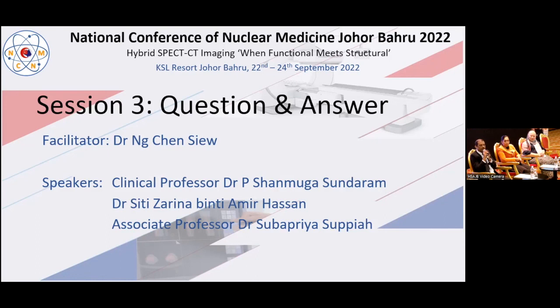Number two, the uptake will be significantly high. Number three, it will be very much seen in both the initial and delayed scans. There is no washout, and even the initial image itself will look like a delayed image with significant uptake. Number four, sometimes, if we are lucky, we may see more than one spot of sestamibi uptake, like lymph nodal metastasis or a distant metastasis. Then you will think in terms of parathyroid carcinoma.